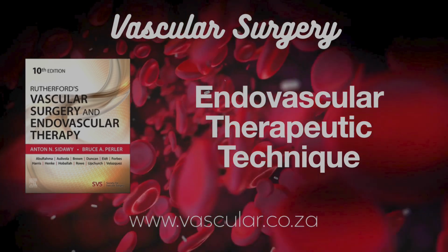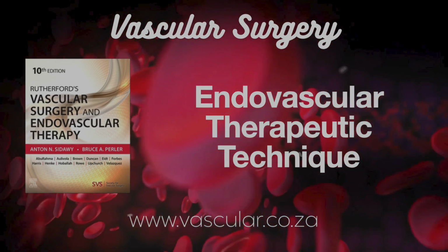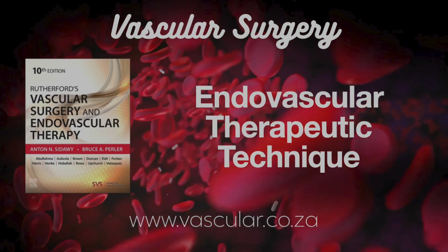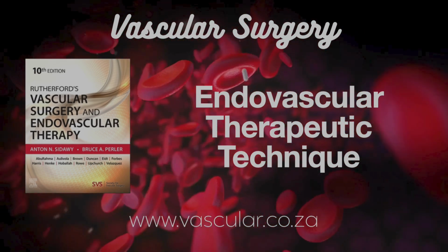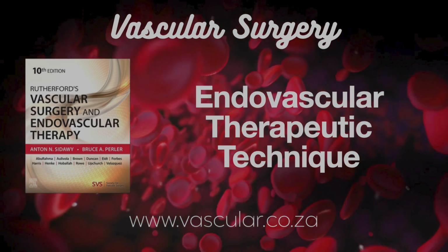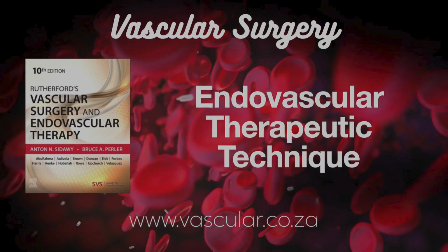Choosing between BES and SES. Key factors again, as we discussed in Table 63.3. BES are great for short, focal, calcified lesions needing precise placement and high radial force, ostial lesions too. Kissing stents at the iliac bifurcation use BES. SES are better for long, tortuous lesions, areas prone to compression: external iliac, SFA, internal carotid, post-stent graft dissections. Flexibility and kink resistance are key advantages there. Consider forces, anatomy, precision versus flexibility needs.